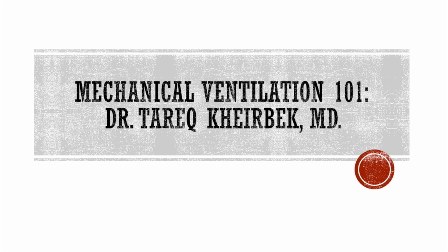So one, I will make sure that if I go up on a tidal volume, I'm not reaching a level of ventilation that's going to result in over distension of the alveoli. Again, I want to keep my tidal volume less than 8 mLs a kilogram of ideal body weight. If my initial settings were based on 6 mLs a kilogram and I have a window to go up on the ventilation, then I would increase the tidal volume or increase the driving pressure that will achieve a higher tidal volume. If I achieved an adequate tidal volume, the other thing I can do is increase the respiratory rate.